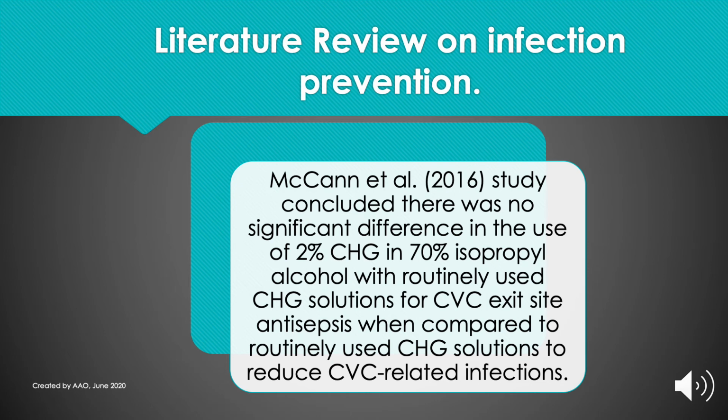What they are suggesting in this conclusion is that as long as the CHG is present, that is the most important thing when prepping the CVC catheter site.